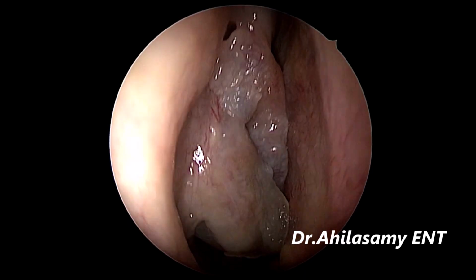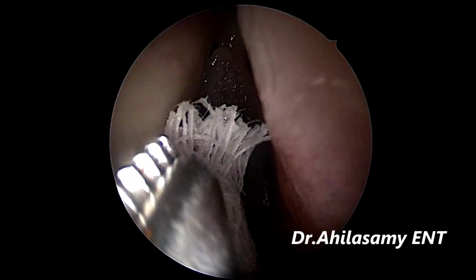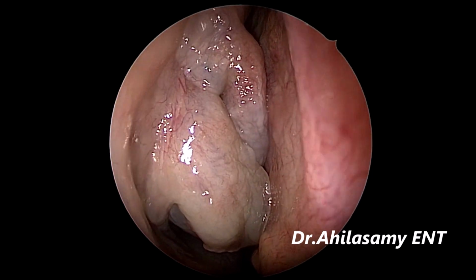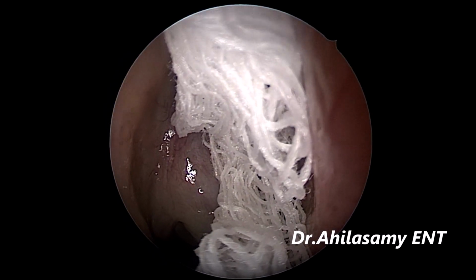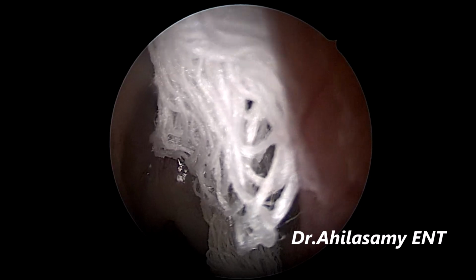This is a right nasal cavity diagnostic endoscopy. The first step is to pack the nasal cavity with the roller gauze soaked in 4% lignocaine and adrenaline in the ratio of 1:1. I take 10 ml of adrenaline and 10 ml of 4% lignocaine. Pack it very well into the crevices.